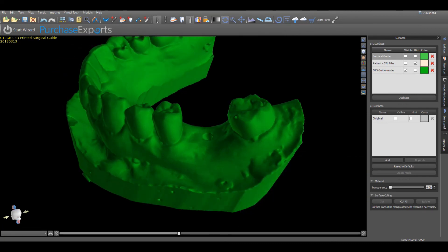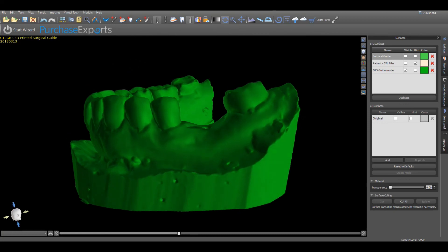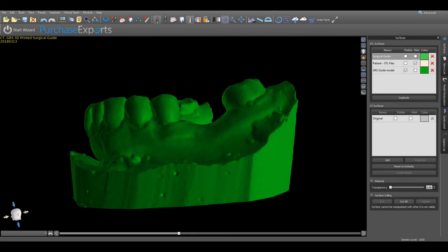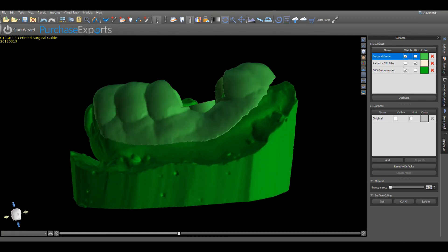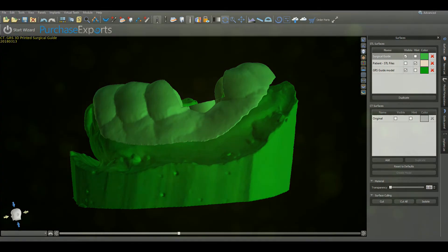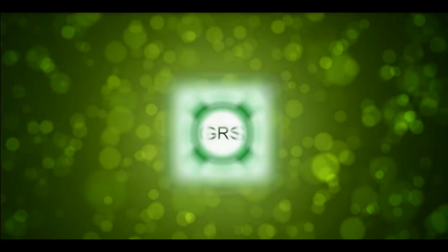Once completed, the newly fabricated GRS surgical guide will serve to provide for the most accurate and precise surgical guide for dental implant placement.